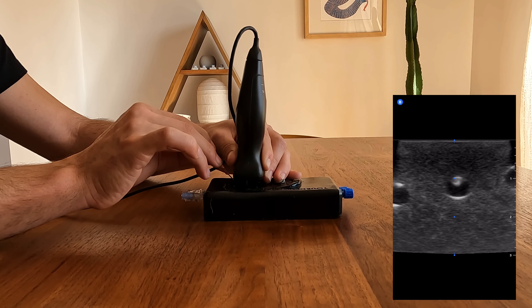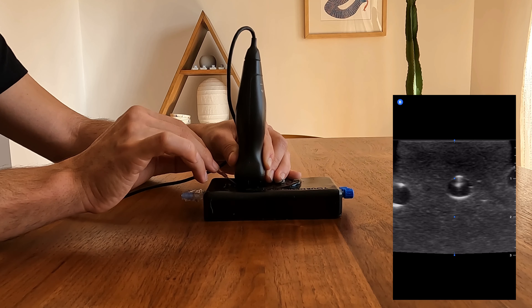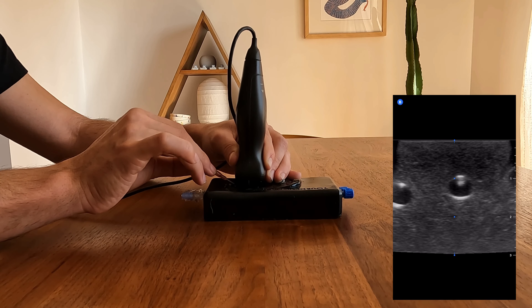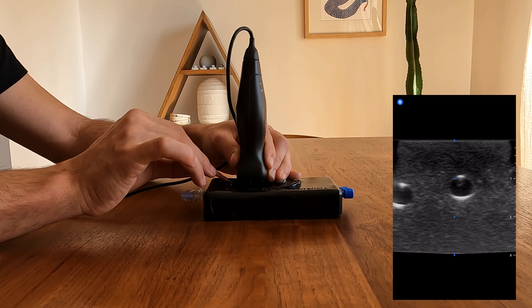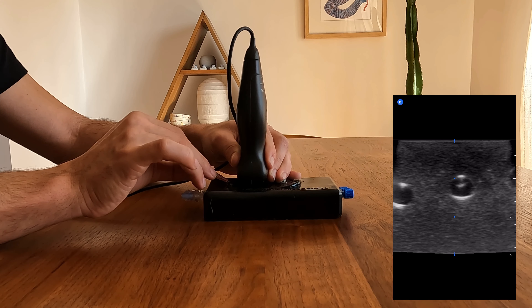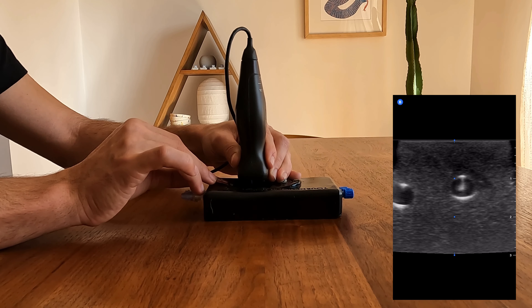Once I get into that vessel, I really want to get that catheter in more, so watch how I drop my angle — I want to get more catheter in but I don't want to go through the back wall. So I'm going to drop my angle and again do needle forward, probe forward, walking that needle into the center of that vessel.